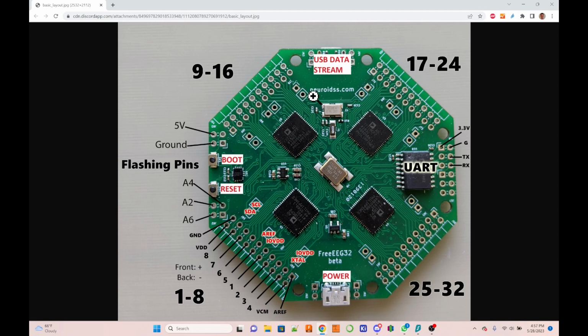Also very important to know is you have two micro USB ports. One of them only supplies the board with power and the other one only streams data. And obviously you need both. So here's the power on this side of the board. And I highly recommend using a power bank, because if you use, like, the USB power out from your laptop, then the whole purpose of having two power ports is defeated. The reason we have separated power is to have a very low noise system. And on the back side of the board there's actually a DC to DC transformer to completely isolate any noise that might come from the power cable.